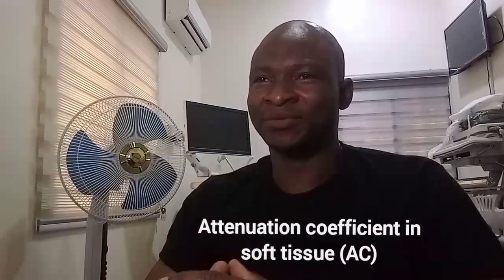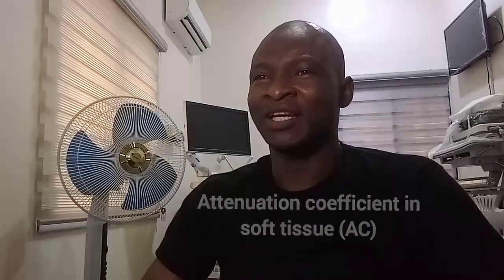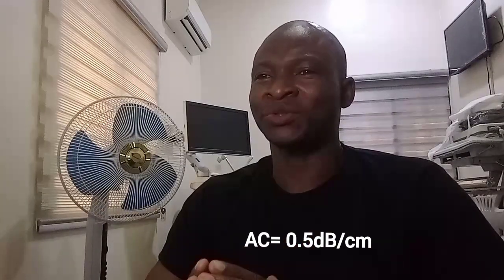So let's look at attenuation coefficient in soft tissue. The typical value for attenuation coefficient in soft tissue is 0.5 decibels per centimeter. This means that for every centimeter that the sound travels through a soft tissue, it is attenuated by 0.5 decibels. Attenuating coefficient is also frequency dependent. The higher the frequency, the higher the attenuating coefficient.